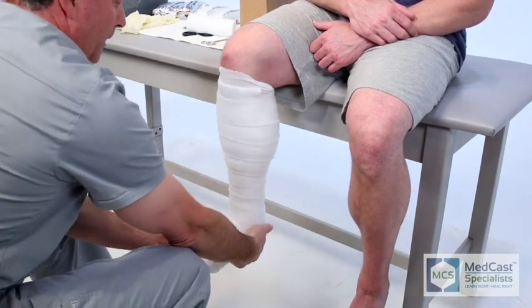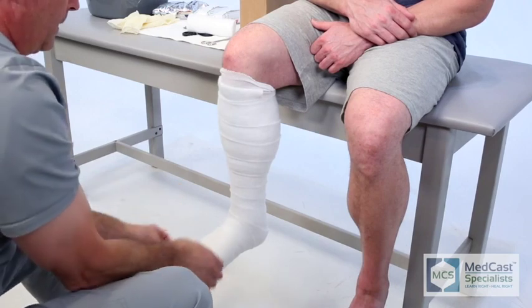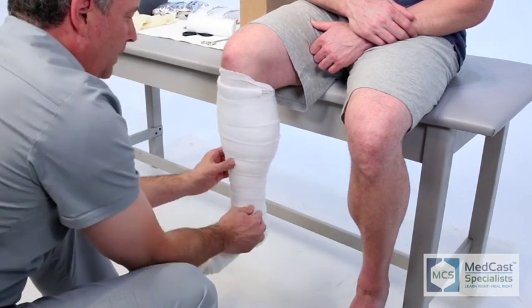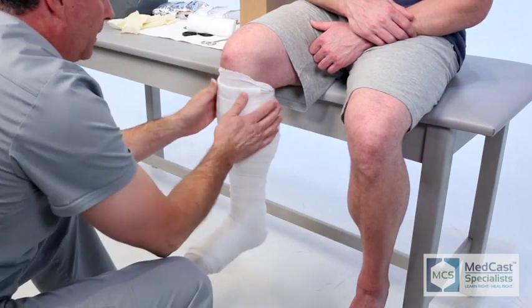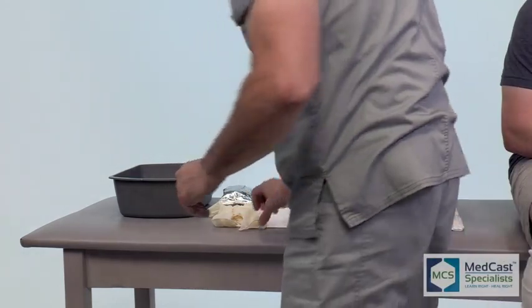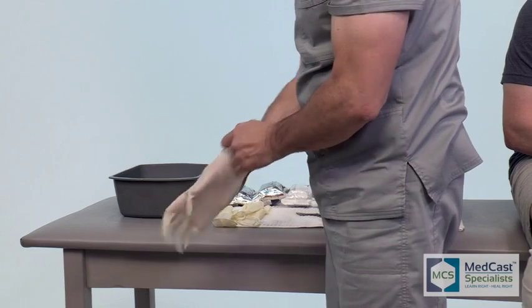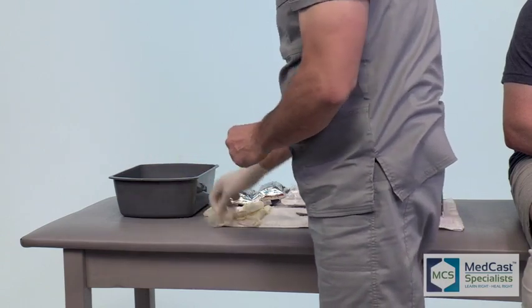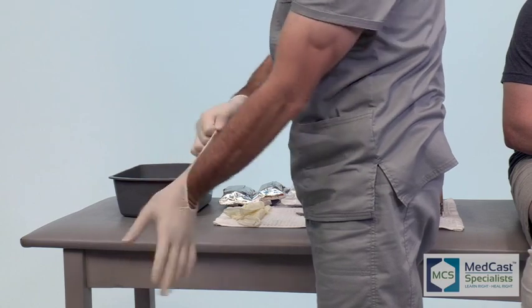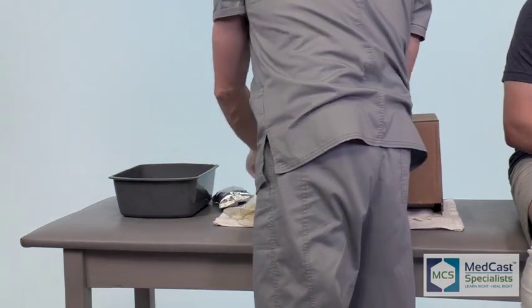With the application of the soft roll, I always have a tendency to put it on fairly snug. It may have a little extra layer from time to time — it all depends. You just need to figure out if this patient will be wearing it for a long extended time or if it will be a short duration. If they're post-surgical, you'll want to definitely give them a little bit of extra padding because they still may have a propensity to swell. Distal extremities always swell a lot, so you have to be cautious of that.